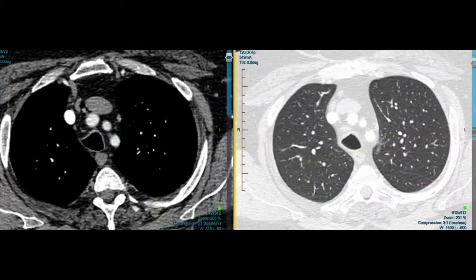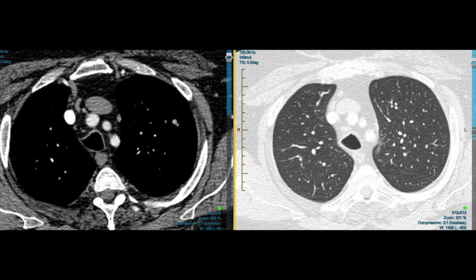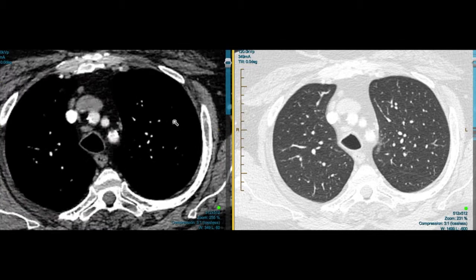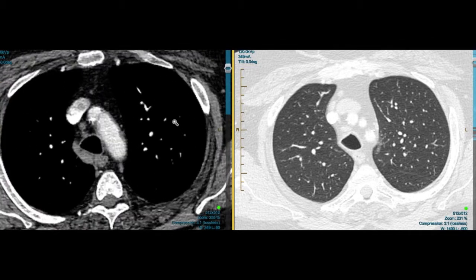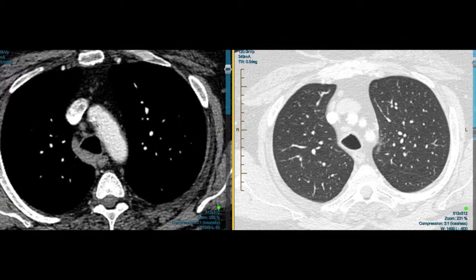Hi, it's Barton Jennings here from Lung & Sleep. I've got an interesting case here of a patient with an abnormality in the right upper lobe. If we start looking here on the mediastinal windows and just scroll through, we can see that the mediastinal lymph nodes are normal.